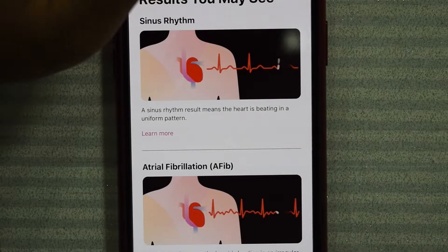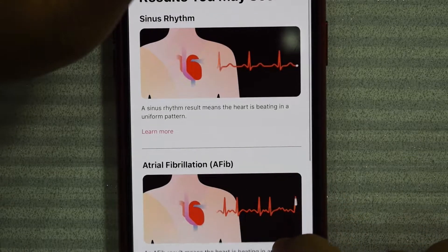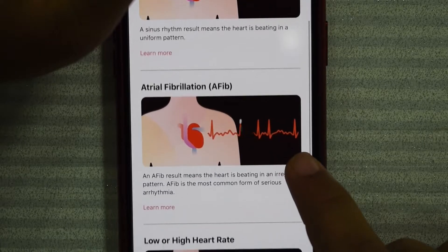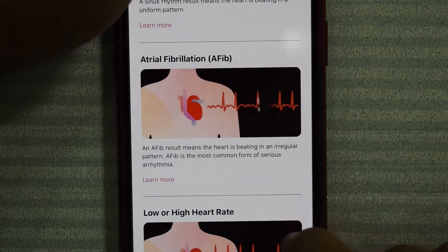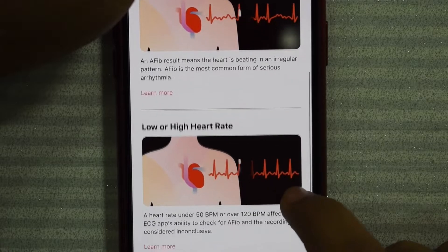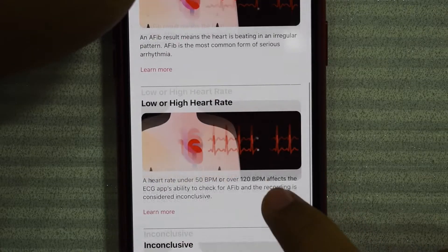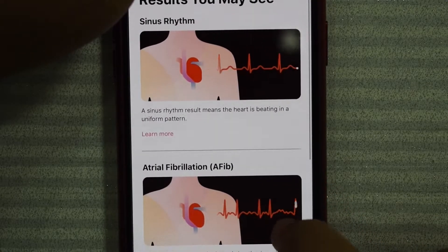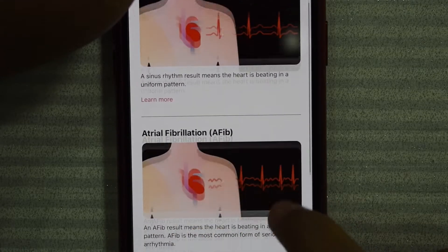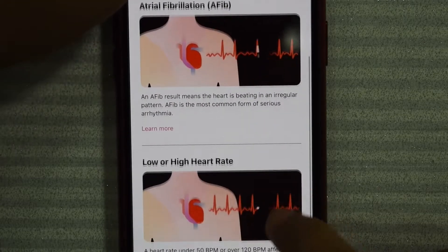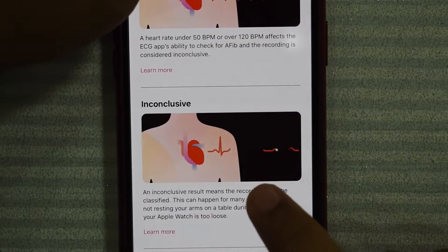Results you may see: Sinus rhythm — that means the heart is beating in a uniform pattern. Atrial fibrillation — AFib — an irregular pattern. And low or high heart rate. And inconclusive. So these are the four possible results: sinus, atrial fibrillation, low or high heart rate, and inconclusive.